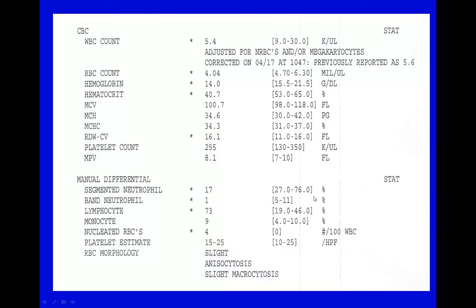They represent a significant portion of the white blood cells. So most white blood cells are neutrophils. What's the second most common type of white blood cell? It's lymphocytes. And so if the lymphocytes elevate, it's likely that the segmented neutrophils are going to go down, because these percentages, the way math works, total 100.